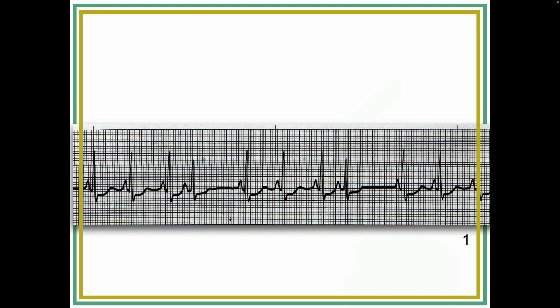Okay. So one not common but not rare pattern is one where it's every other beat. And that's common enough that we have a term for that called bigeminy. And sometimes it's every third beat, and we would call it trigeminy. But even if you have bigeminy or trigeminy, where it's every second, every third, whatever it is, there's no rule that says it has to be like that, so maybe it'll go through a patch where it becomes irregular. So you'll see everything. Thank you.